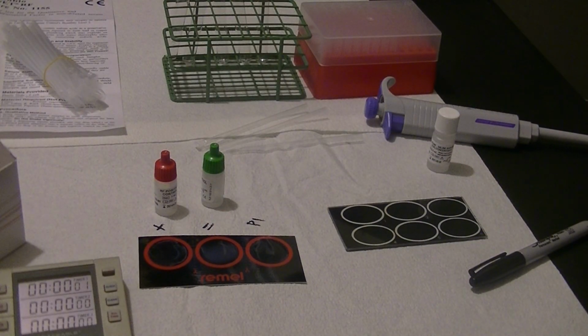Now, also in the directions, there is a semi-quantitative method, where you would actually perform what's called a titer. In a titer, as we discussed yesterday in the dilutions lab, we make doubling dilutions of a patient sample and retest each of those dilutions the same way we tested the undiluted patient sample.